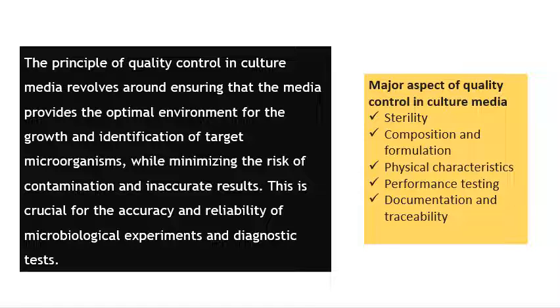So, we will look at the major aspects of quality control of media under the following headings: sterility, composition and formulation, physical characteristics, performance testing, and documentation and traceability.